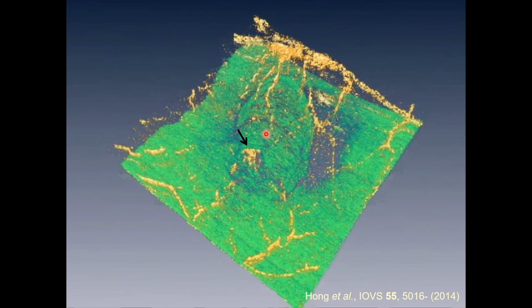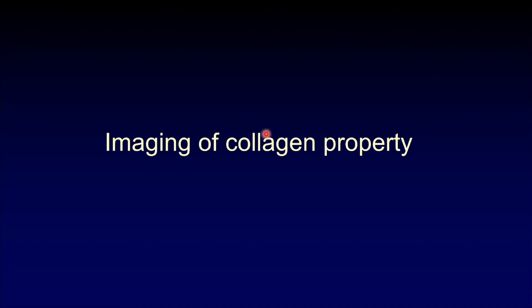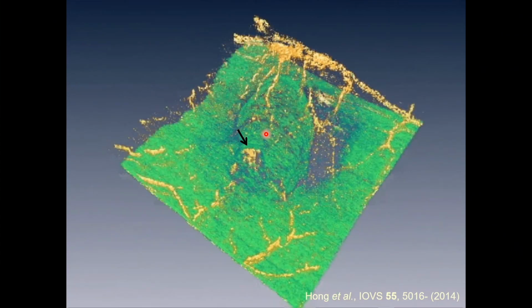By removing it, we now see only the retinal pigment epithelium. This one is, by the way, shadow. It's not normal, but there is still a retinal pigment epithelium. This one is the abnormal absence of the retinal pigment epithelium. It's RPE damage. This is information the clinicians want to measure, and now we can measure it with a single scan of the Jones matrix OCT.